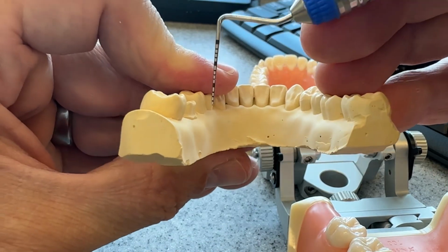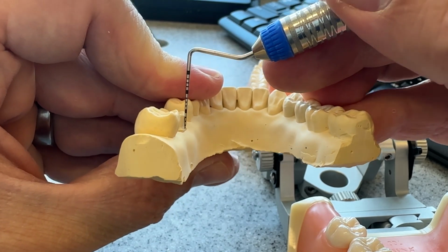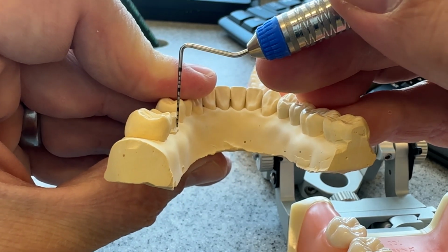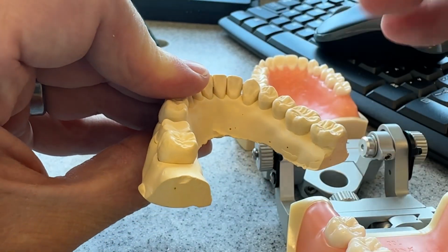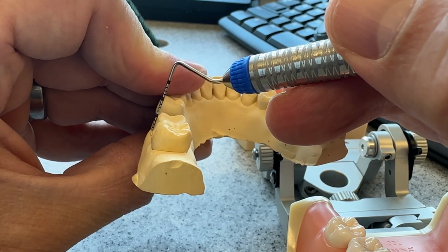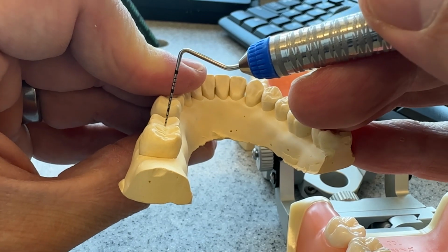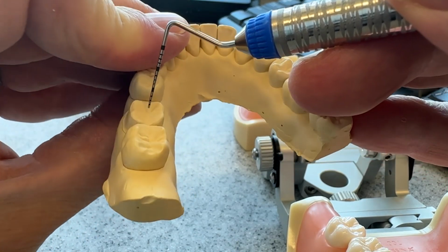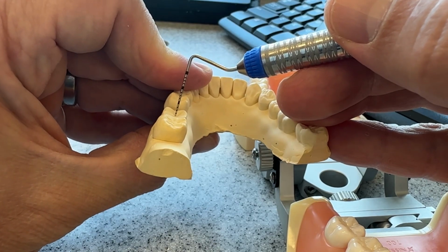tilt. What that's going to come from on your prep is your lingual surface being kind of straight up and down, maybe with a slight tilt to the lingual, and then your buccal surface will have a decent amount of taper with a definite slight lingual tilt, and the average of those two will leave your long axis of draw slightly lingual.